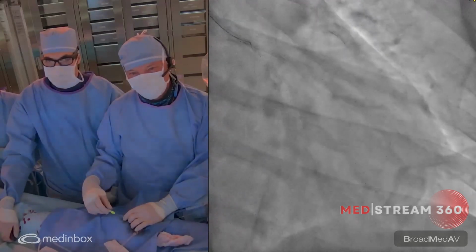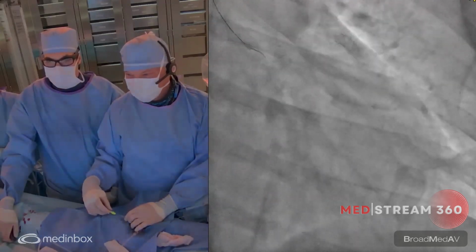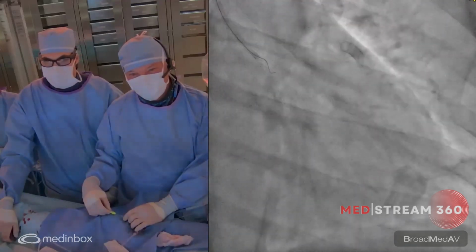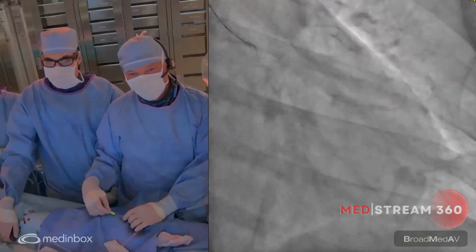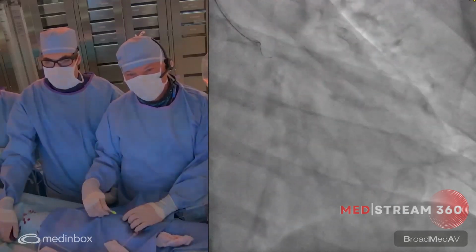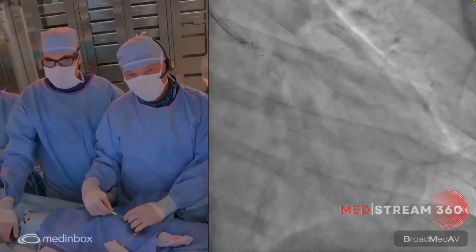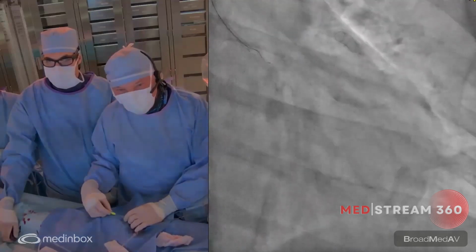Find the channel. I was able to go through a very small branch, which was going just at a 90 degree angle from the circ. And then I went to the distal lumen, but the Pilot went through, I would say, a little bit more easily.